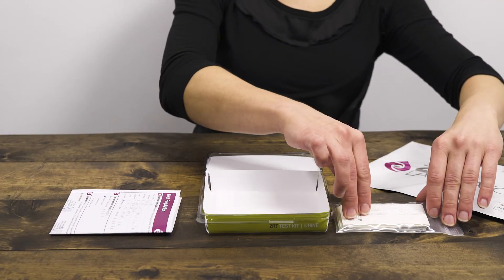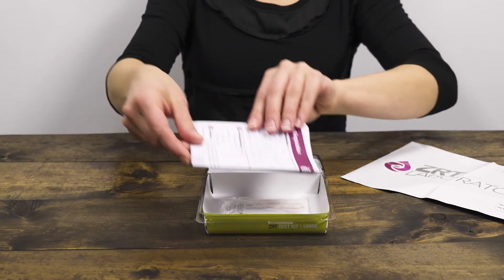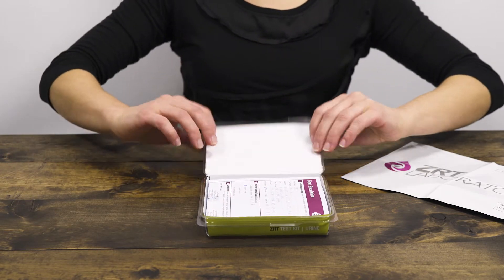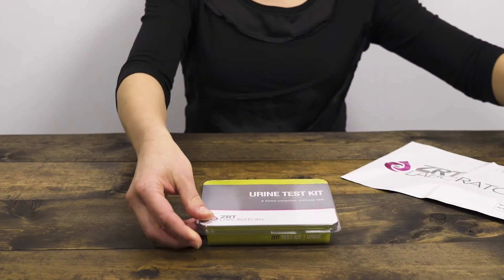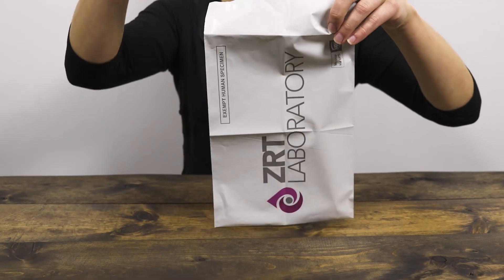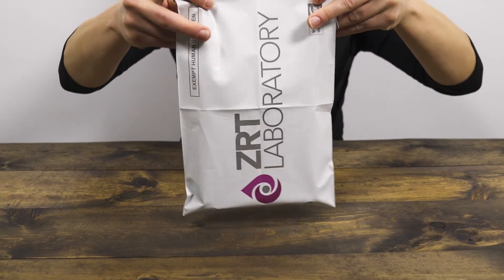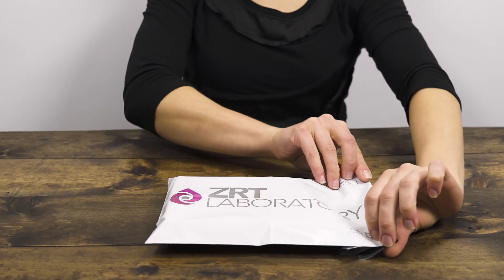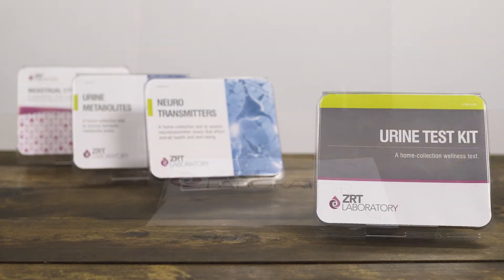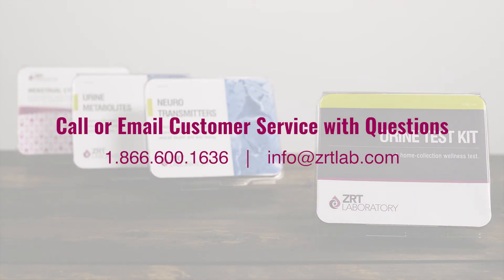Place the plastic bag containing the collection cards and the completed test requisition form back inside the test kit. Snap the lid shut and place the entire test kit inside the return packaging. Attach the provided prepaid label or other postage if required, and then return using the appropriate carrier. If you have any questions regarding your collection, please call or email our customer service department.